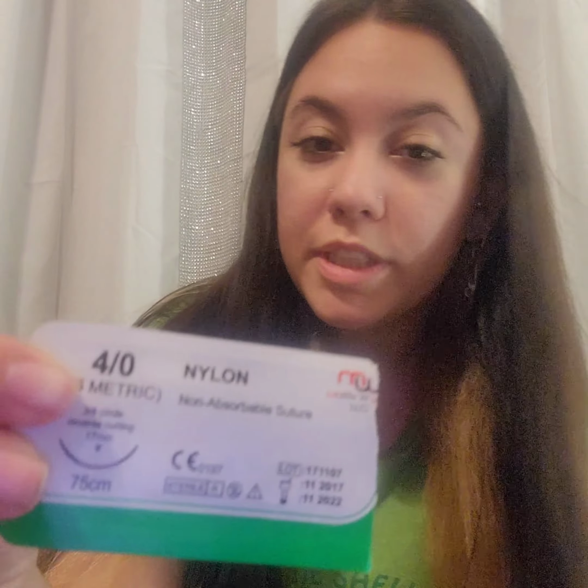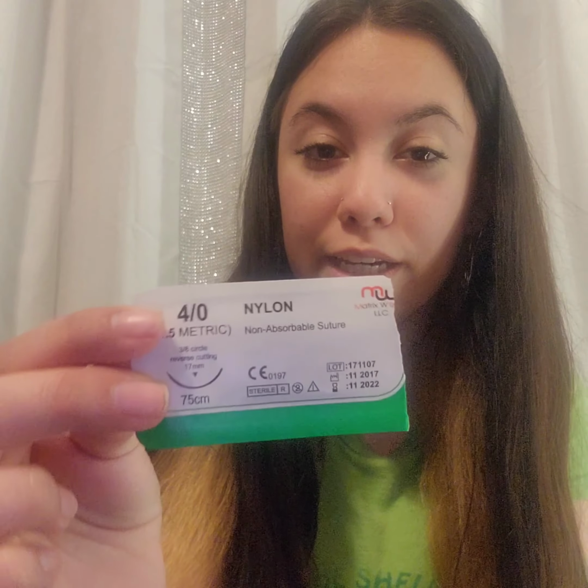So before I get started with the demonstration, let me show you what I will be using and what you typically need for a suture or a wound. I got very lucky and I talked to my GCI teacher because we were doing skills in class. So I got some suture material, which is just the needle and thread that they use.